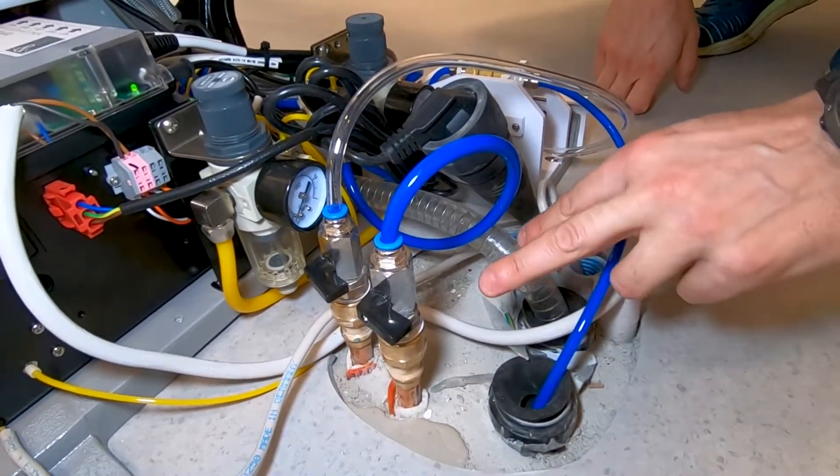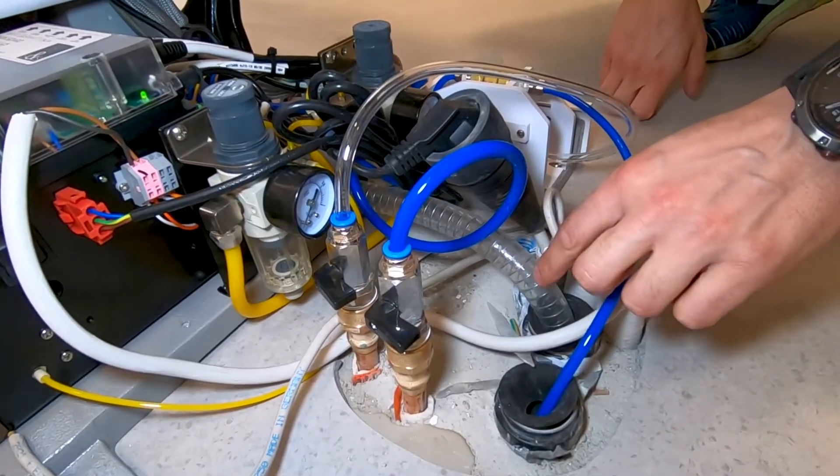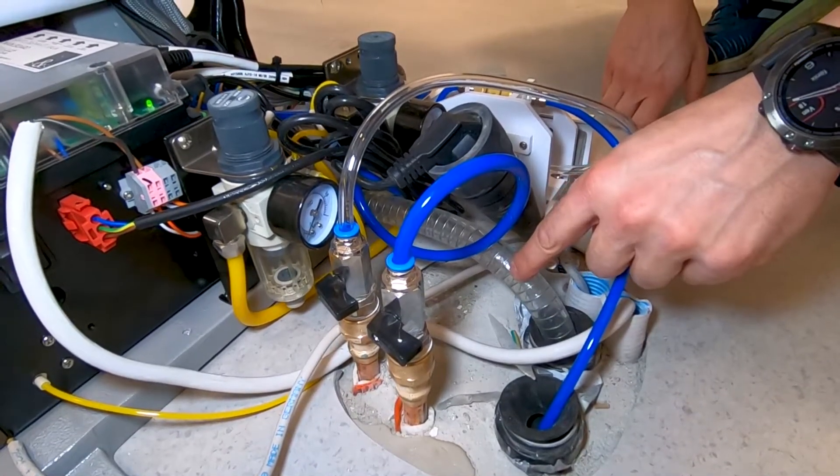As you can see, you don't have two pipes that arrive at the chair base, but you have only the pipe for the suction. So the basin one is already inside here.